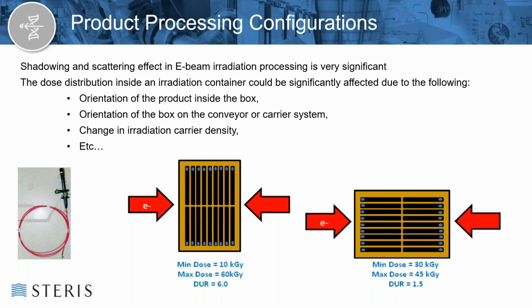So considering these two diagrams on the bottom, that one on the left, you're penetrating looks like 9 units. That one on the right, you're penetrating 2 units, left and right. So oftentimes trying to penetrate fewer units can lead to better DUR results like you see there.